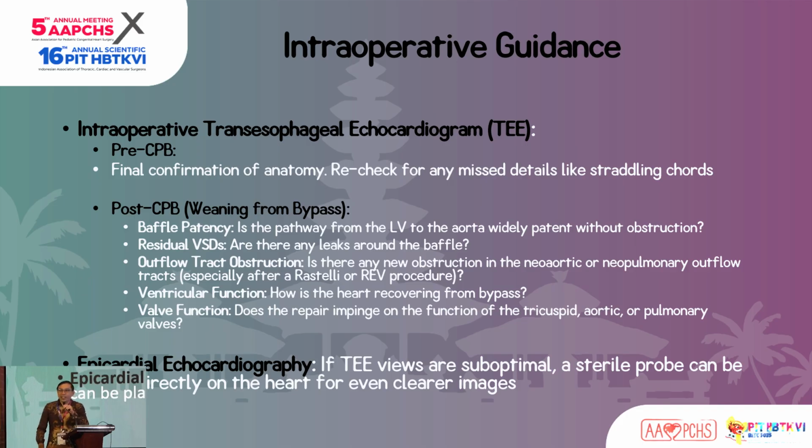So I realized I closed the wrong hole. That was very important because I would have tried to come off bypass, assuming that I did the right thing, that I closed the right hole. So I redid the VSD patch, and the post-op echo was good. So to optimize surgical outcome, I actually feel intra-op TE is very important for us as a surgeon.